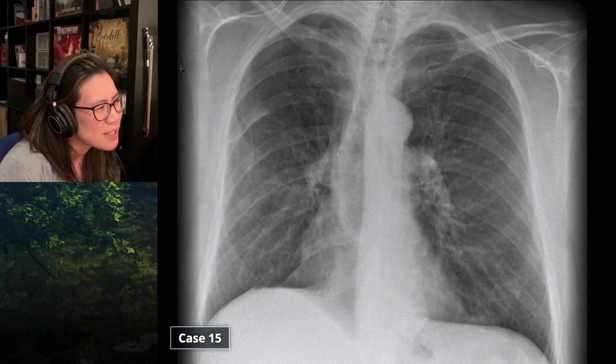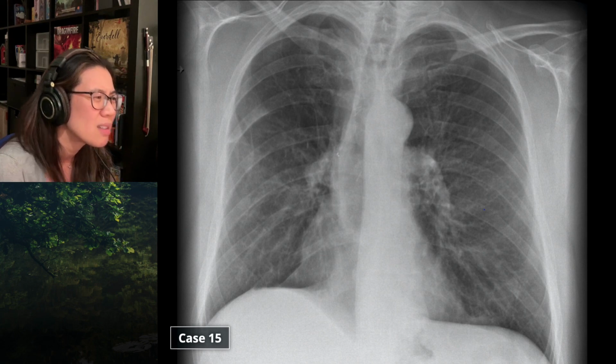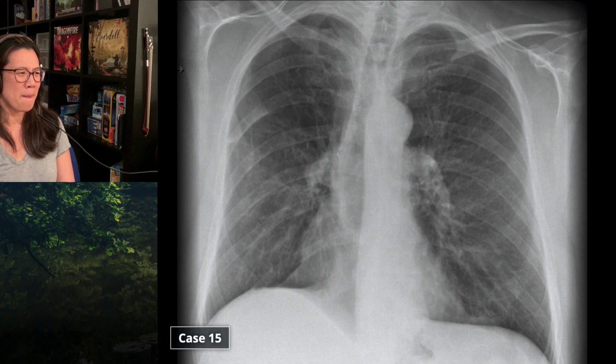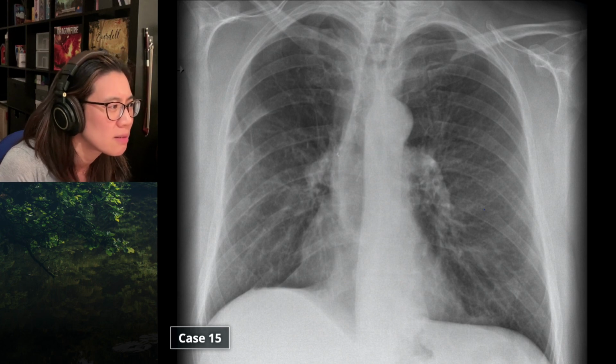There's a funny kind of density projected over the right anterior third and fourth ribs, which I don't think are ribs. Oh, no, I think I'm making it up. Hold on. You're talking about that linear opacity? Yeah. Is it the edge of the scapula or is it medial to that? I think it's medial. And it looks like the pleural edge, perhaps. Oh, yeah. It's a funny looking vertical line in the wrong place.